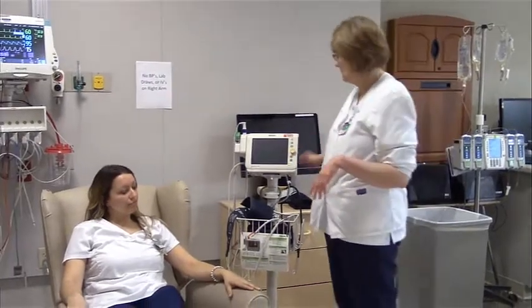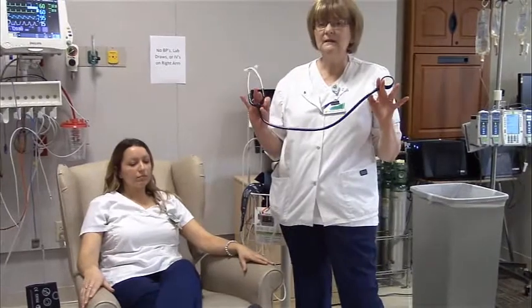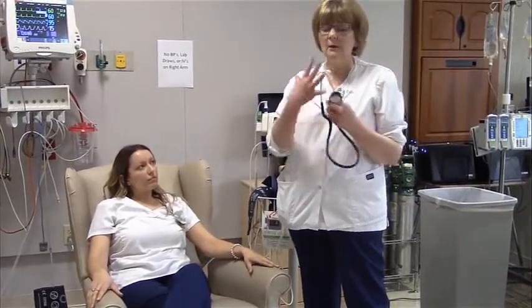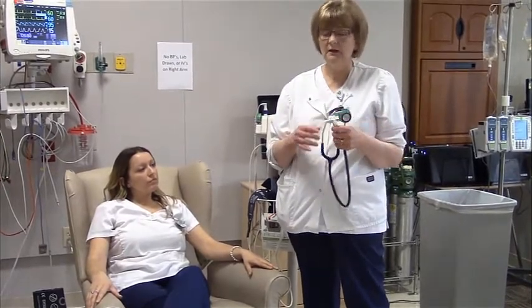Another pulse I want you to be aware of is an apical pulse. For that one, you will need a stethoscope. The nurses do carry them. Some units have them available for you. Make sure you wipe it down so it's nice and clean for your use and the use of the patient.